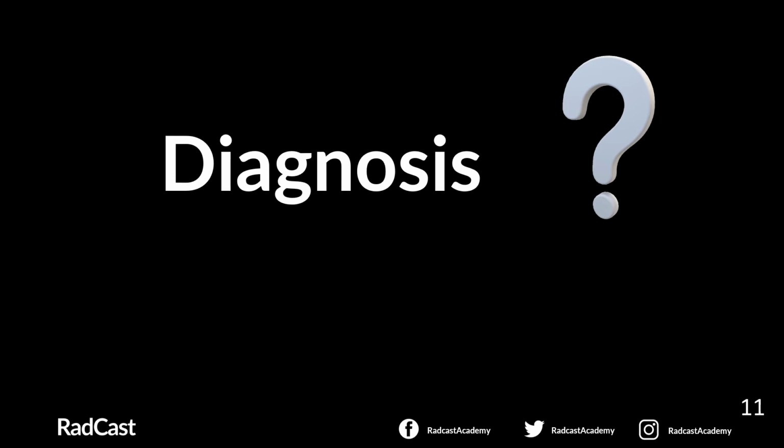After the diagnosis of subarachnoid hemorrhage is confirmed, further imaging should be performed. Why? To characterize the source of hemorrhage, such as doing CT angiogram, MRI angiogram, and digital subtraction angiography. Don't worry, we will talk about that.